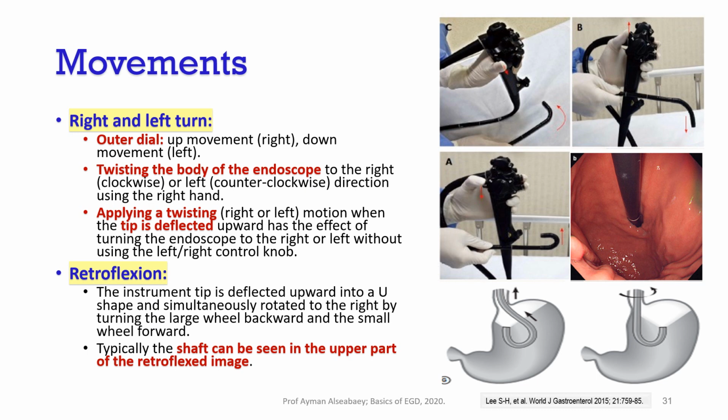So I will try to teach you now how to avoid using these wheels.